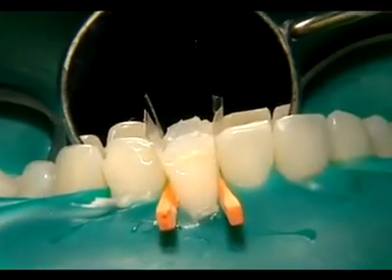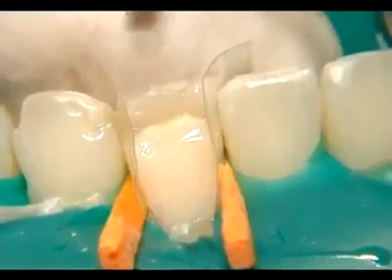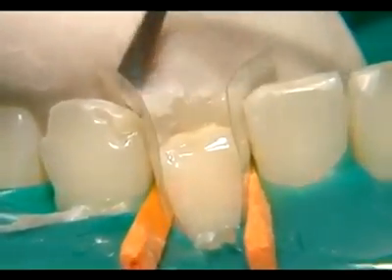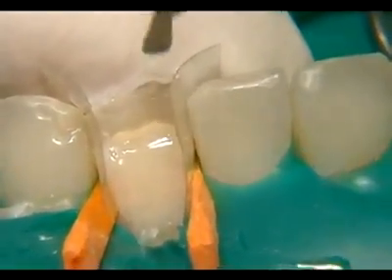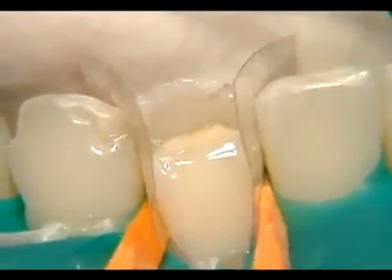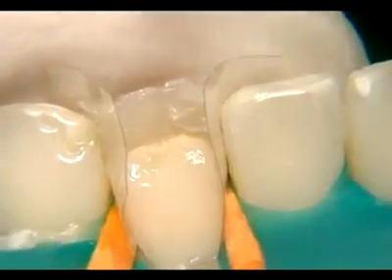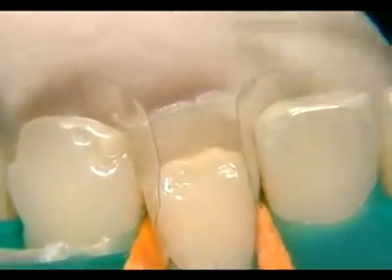After the first increment has been applied, the composite is briefly light cured and the position of the increment is checked. Next, the increment is completely polymerized. Subsequently, the index finger is again placed behind the incisor. The lingual wall is now built up to the height of the incisal edge, using clear enamel material. Then, the second increment is polymerized.